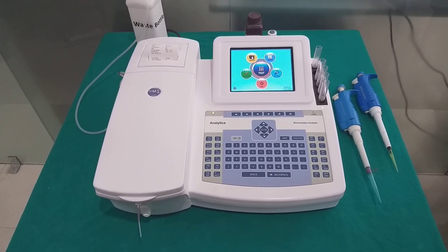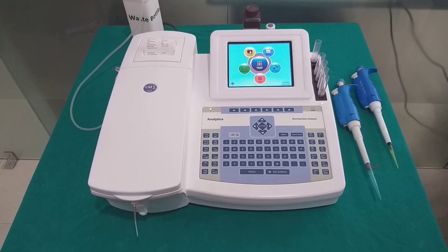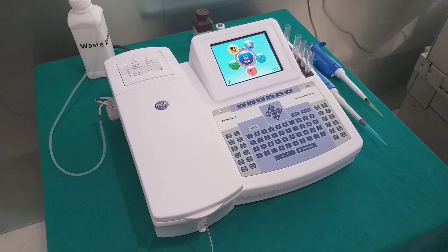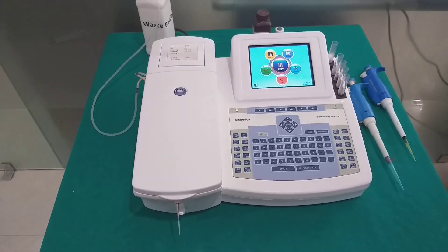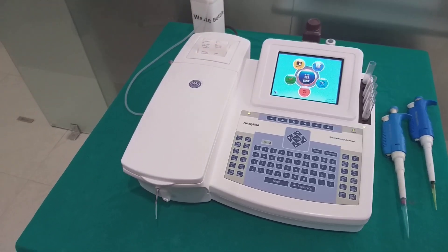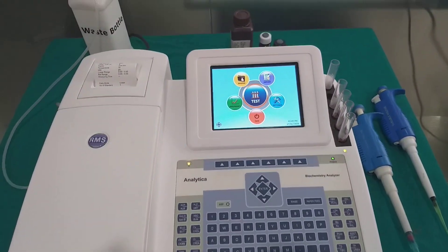Hello everyone, today we will talk about Biochemistry Analyzer, Analytica 705. Analytica 705 is an ideal biochemistry analyzer which combines the benefit of superior technology to ensure accuracy and ease of use with value for money.